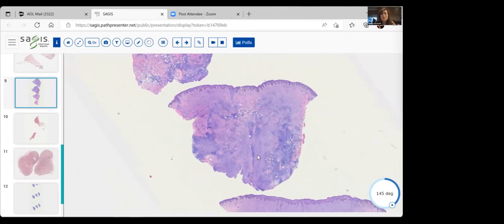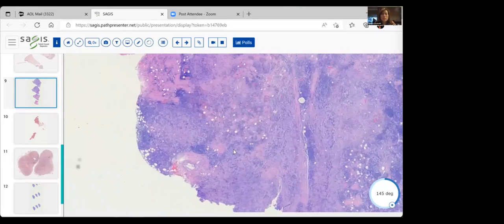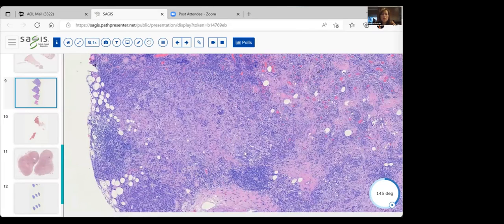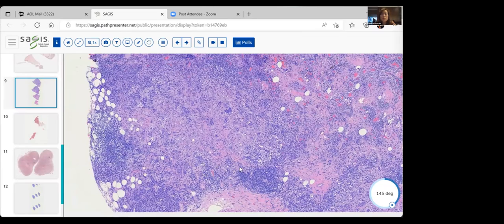Even from this magnification, you see light cells. Again, light cells typically mean that you have larger cells or cells with some cytoplasm in it. And then you have these darker areas, which often are lymphocytes or cells with very little cytoplasm. So let's take a look at what cell types we're looking at here. I'm going to move over to this side. And what you can see here even is already perhaps a foamy appearance to those histiocytes. You're all familiar with foam cells now.